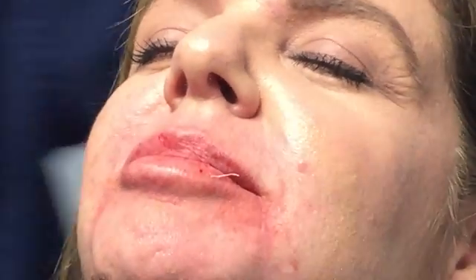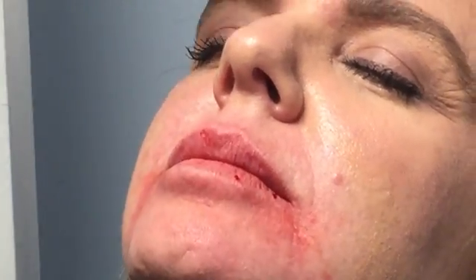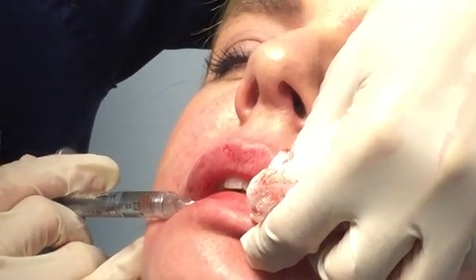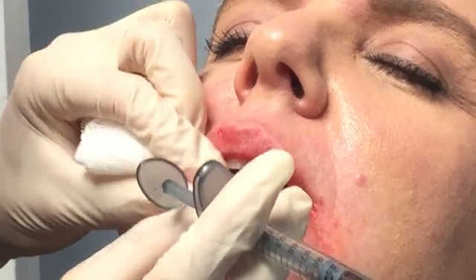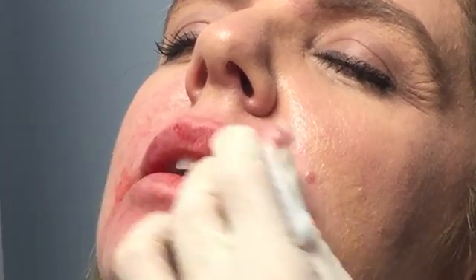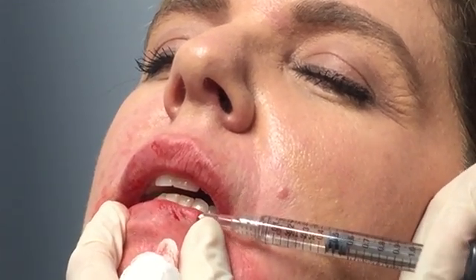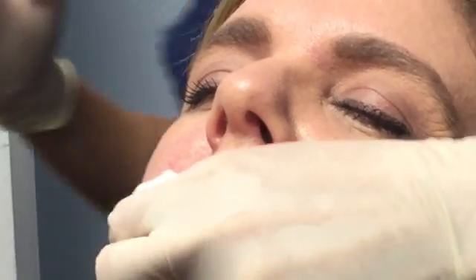Lori, are you still comfortable? I am. Okay, good. For lip injections, we really want to be slow and methodical. I don't want to go too quickly. We want to make sure that it's all symmetric. Now I'm just going to add a little volume. I'd like to do more in the center than the sides, because if you add too much to the sides, you get quite a bit of volume where it's not supposed to be. We're supposed to have more volume in the center of our lip rather than the outside of our lip. Okay, we are done with volume here.